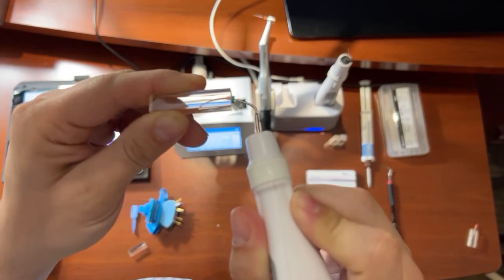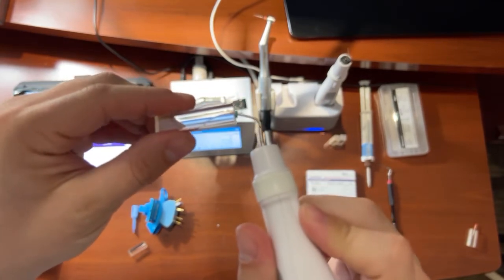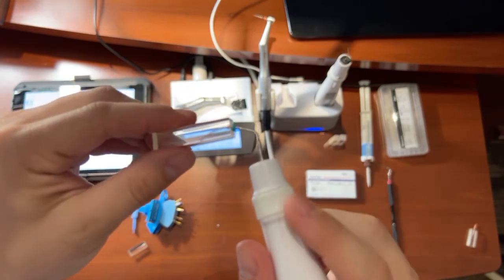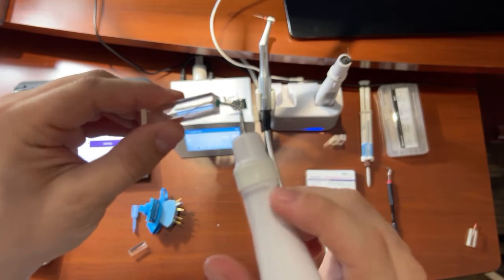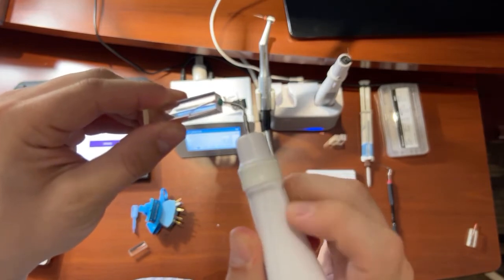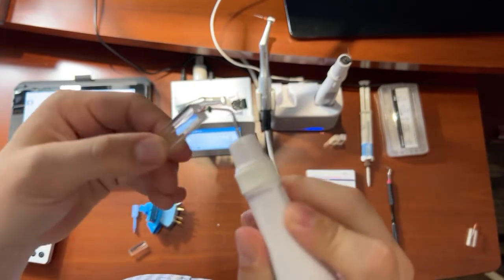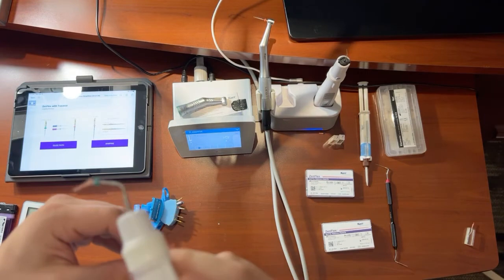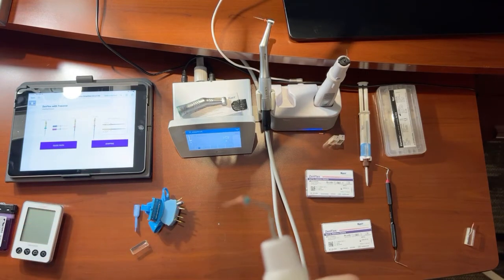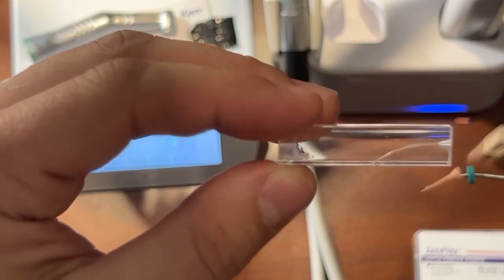Then what we're going to do is do a separation burst. So it's going to be 1 second of heat, 1 second cool, twist, and out. So now we're going to do 1 second heat, 1 second cool, twist, and out. And it's going to pull off all that gutta percha right there. So you see that gutta percha. Let's see if I can see. There we go. So we created that apical plug.